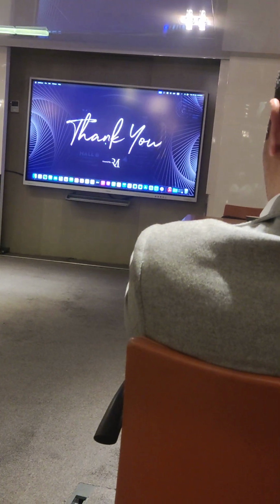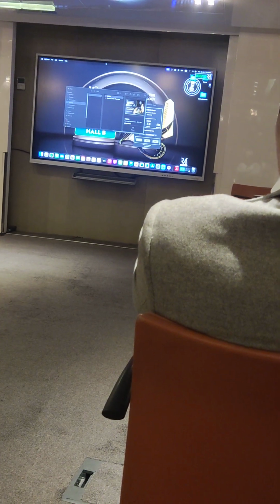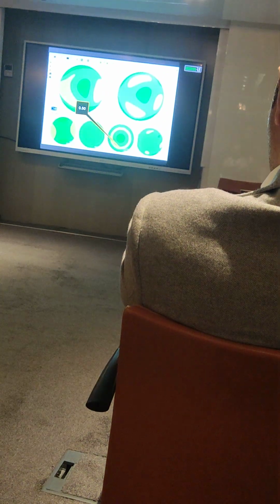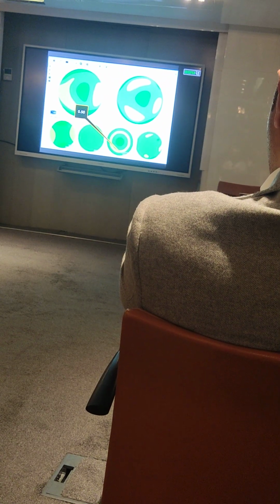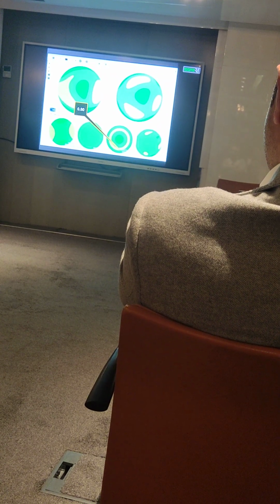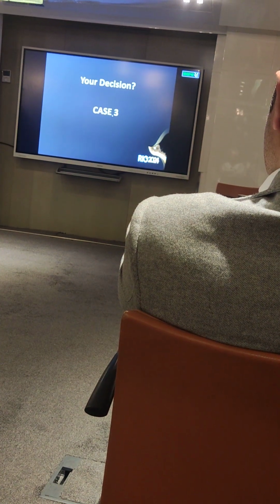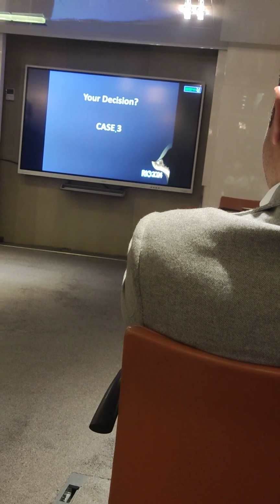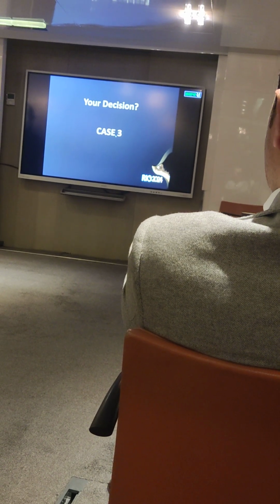So in such a case, what lens do you put? Let's assume that the patient doesn't have astigmatism. What lens do you put? And as you see, it is positive spherical aberration. And the patient would like to have depth of focus after the operation, would like to maintain the depth of focus.